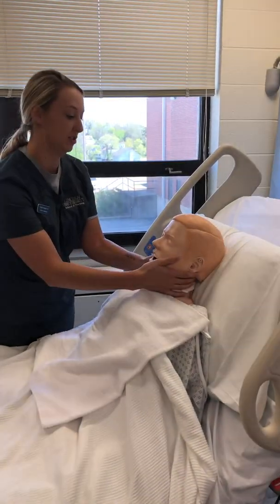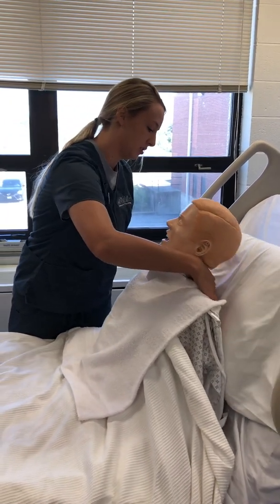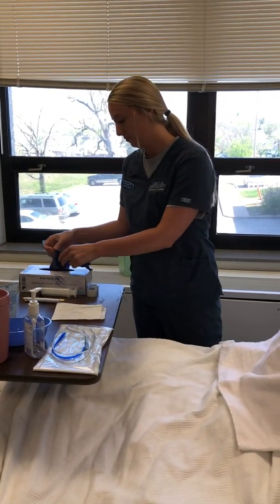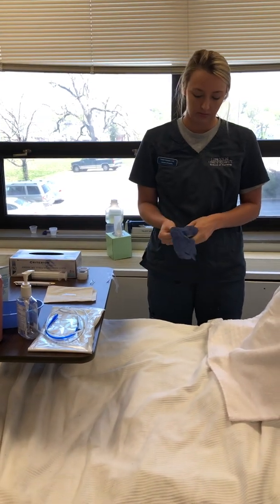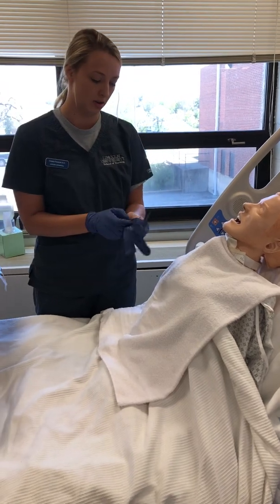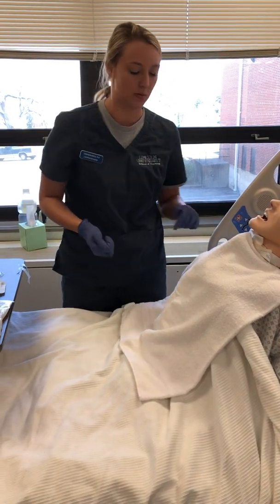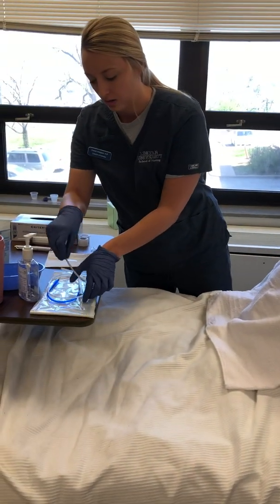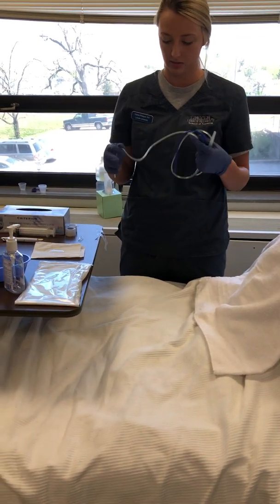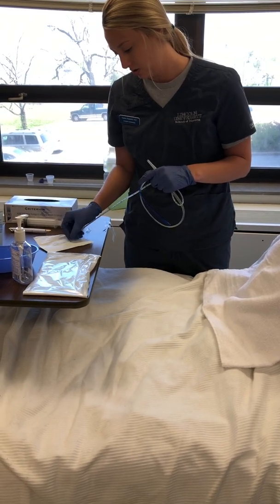I'd have the patient towards me. And then I would first want them to hyperextend their neck, so the pillow under them. And then I would check which nostril I'd want to use. I'd hold one of them and tell them to breathe out, and check the other one to see which one I want to put it in. And then I would put this tight and then release it to make it easier to put in, and lubricate up to 4 inches.